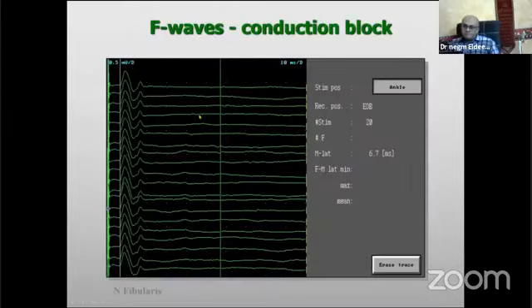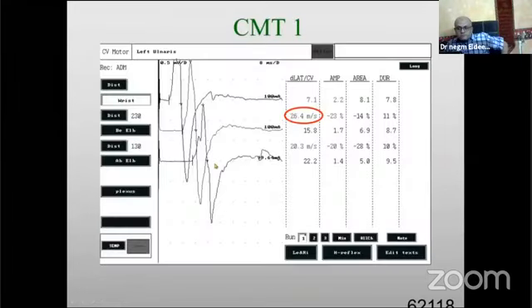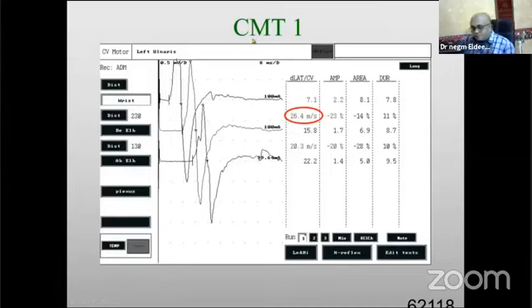If we have conduction block in the Guillain-Barré anywhere along the nerve, above or below the stimulation, we do not produce any F responses. So that is empty. Here's another technical situation where we have the Charcot-Marie-Tooth type 1. And first of all, you see a lot of late components here, very pronounced. The velocity is 26 meters per second, so that is half of the normal.